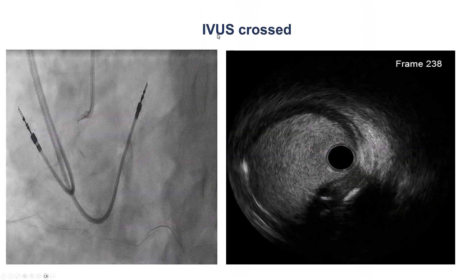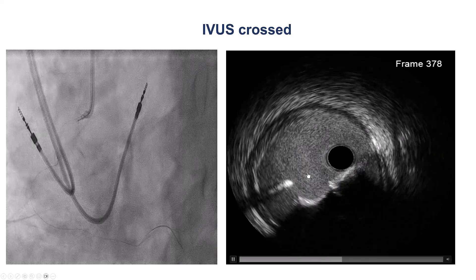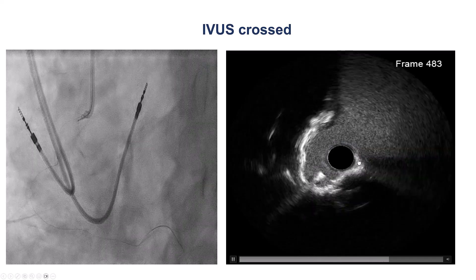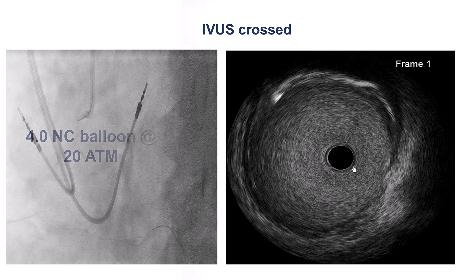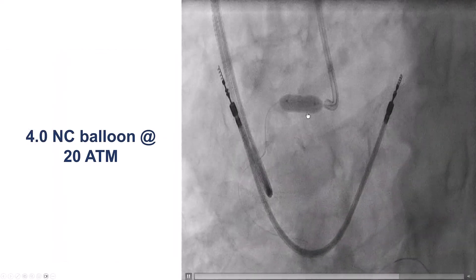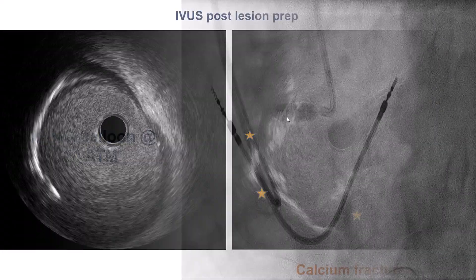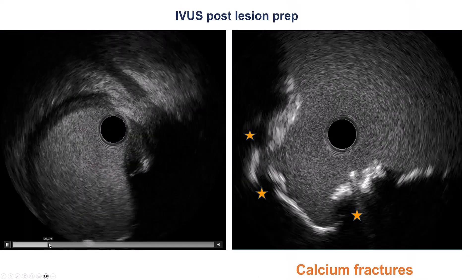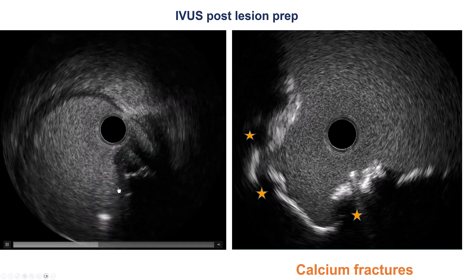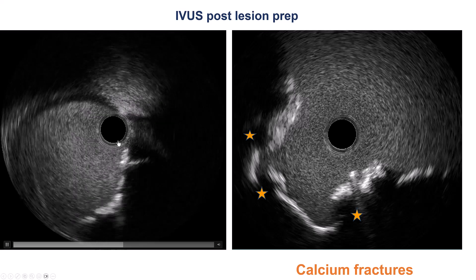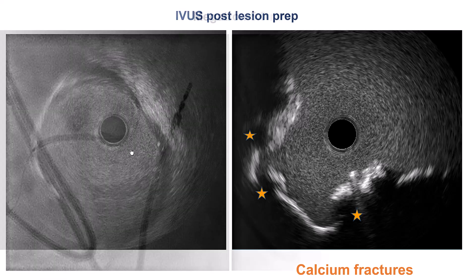After doing the atherectomy, we were able to insert the IVUS catheter. Now doing a pullback, we can see the heavy calcification of the ostium of the RCA, but the calcium has been disrupted. We then performed pre-dilation with a 4.0 mm balloon that expanded nicely. Repeated IVUS showed that there is still some calcium at the ostium; however, the calcium has been fractured and we have a nice lumen area at the ostium.